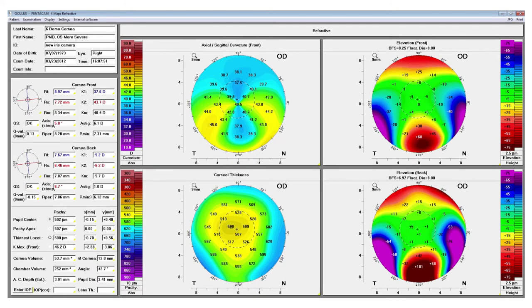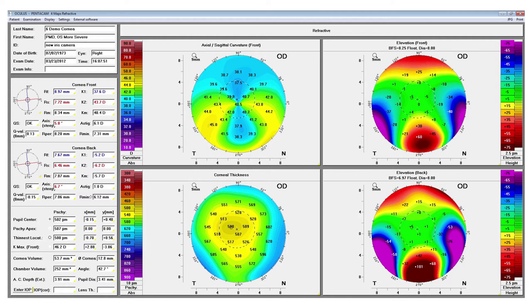Here's an example of a patient with pellucid marginal degeneration. We see that classic kissing birds pattern on the anterior curvature map. We do see some abnormalities on the anterior elevation and posterior elevation, and we see some inferior thinning on the pachymetry map.